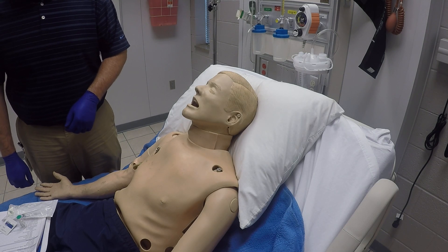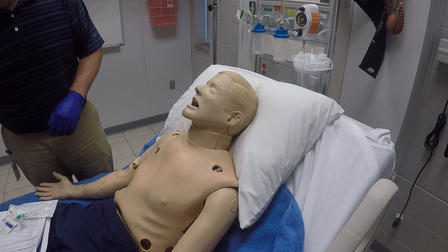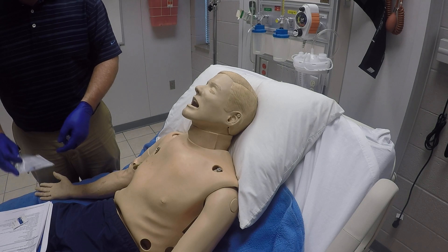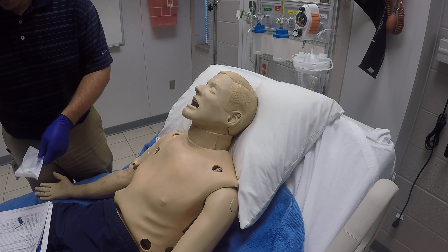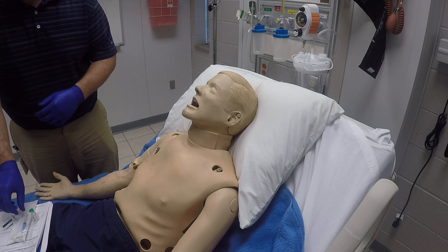This is intranasal medication administration. First thing we want to do is check all of our equipment and make sure we have the right medication we're going to give. We have an appropriate syringe with a needle for drawing it up, and also a mucosal atomizer device. We have a sharps container by our side, an alcohol swab, and some sterile gauze in case we need it.